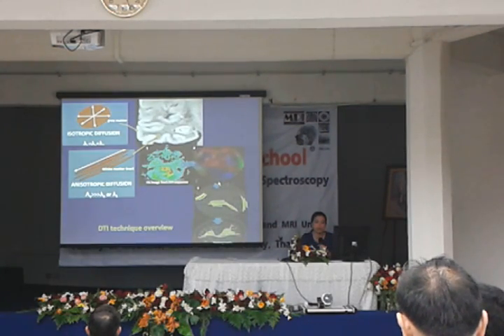And in the MRI scanner right now, the new machines have software that can connect the fibers and make a fiber track in the brain.